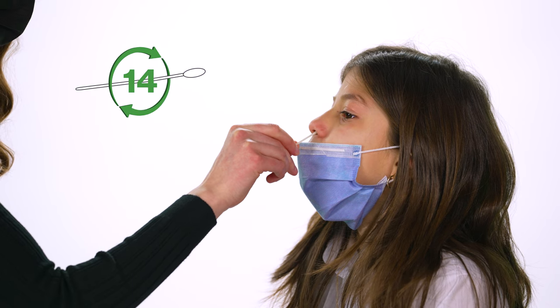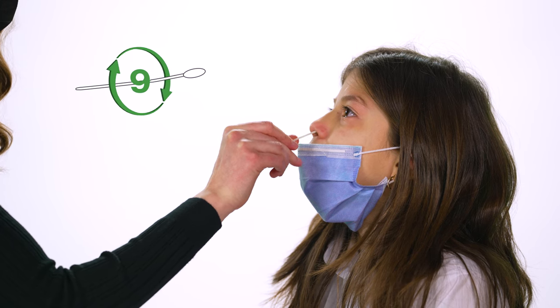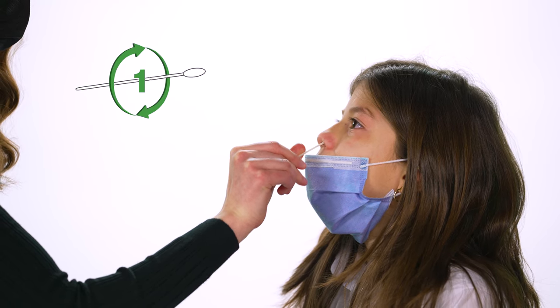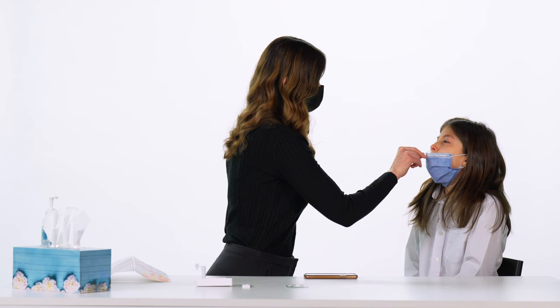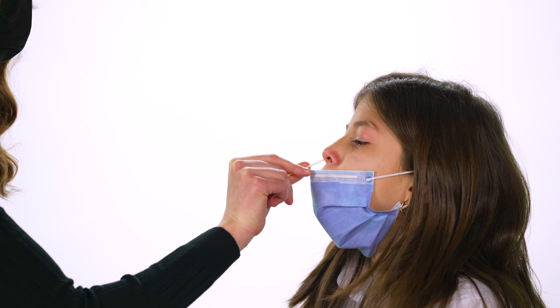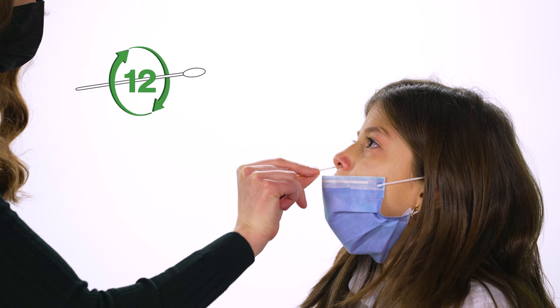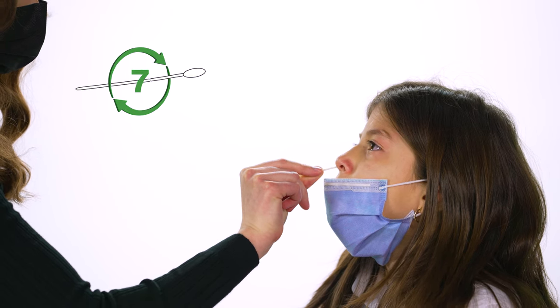Using a wide circular motion, roll and twist the swab against the inside of their nostril at least five times, making sure to swab all around their nasal cavity for at least 15 seconds. Slowly pull the swab out of the child's nose while twisting. Repeat on the other nostril using the same swab. Do not put the swab with the sample back in its original packaging. An adult should conduct the remainder of the test procedure. The procedure is the same for samples collected from a child or an adult.